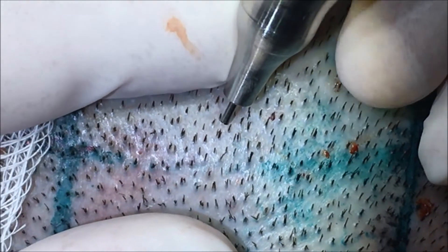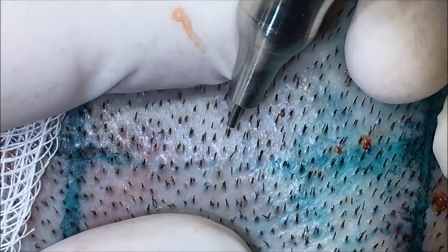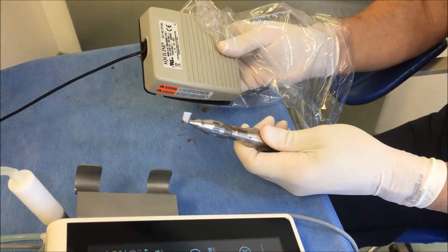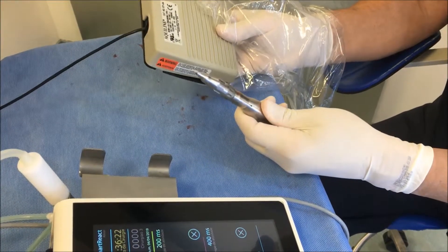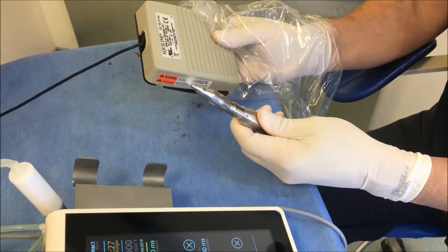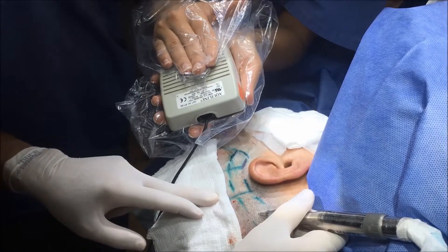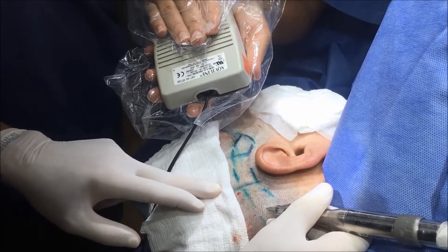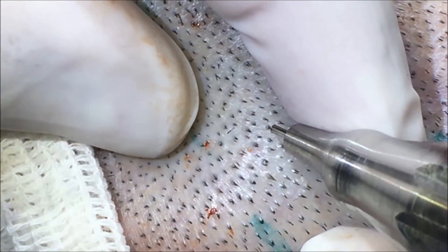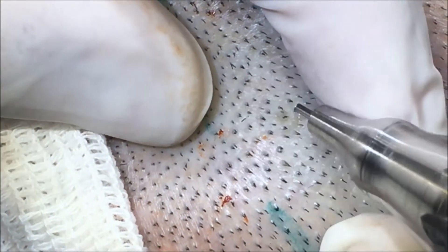When you are starting or haven't acquired speed in FUE, you need more time for correct alignment and engagement. In this case, I suggest using the pedal instead of the smart reaction, because you can do the correct alignment and proper engagement, and just after that you press the pedal to start to rotate.